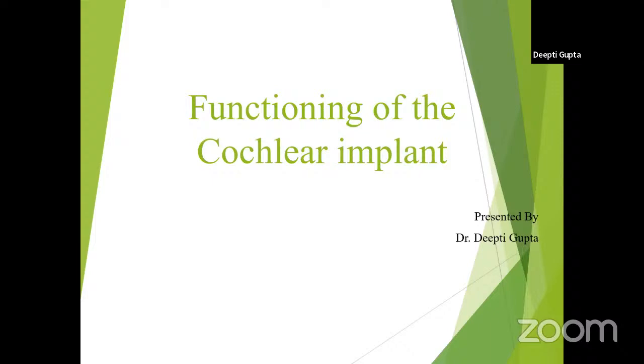So before proceeding further to the topic, I just wanted to explain in simple words what a cochlear implant is and how it is beneficial for us. In simple words, a cochlear implant is an electronic device which gives the capability to hear to a user who is hard of hearing, has become deaf, or was born deaf due to some reason.